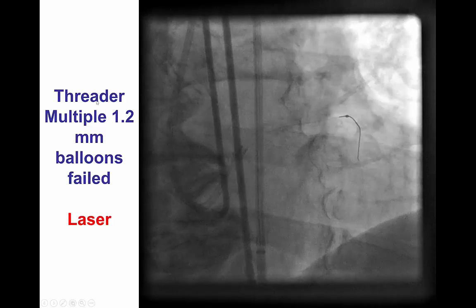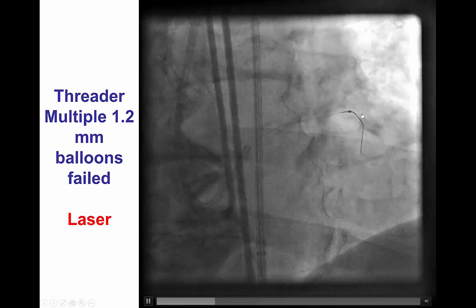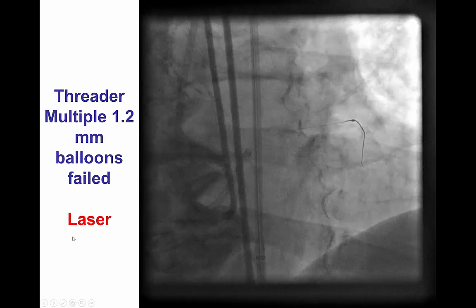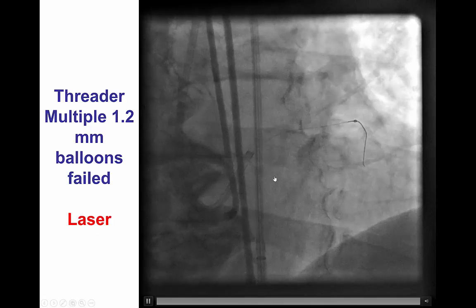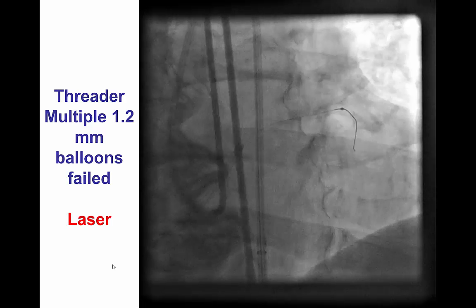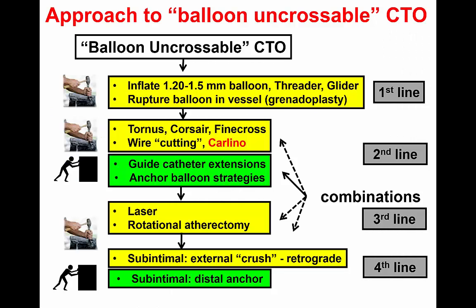The first step for balloon uncrossable lesions is typically using a threader or low-profile balloon. We used the Rapid Exchange Threader, which however could not cross. Several 1.2 mm balloons did not cross either, and we finally used laser. Potential options at this stage also include rupturing the balloon into the vessel — the so-called Grenadoplasty, or Balloon Assisted Microdissection (BAM).